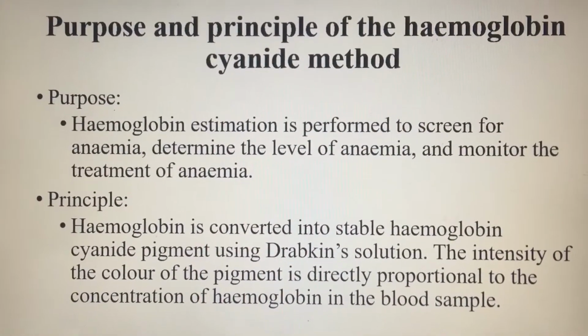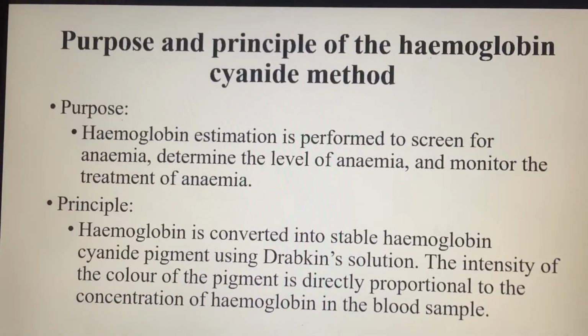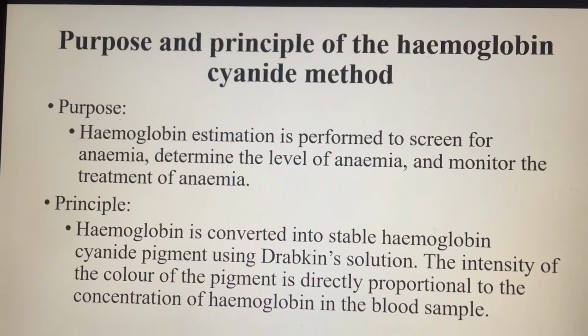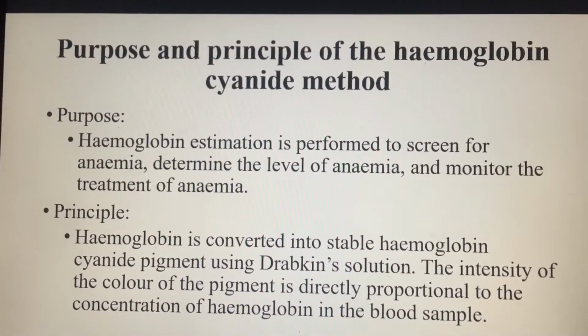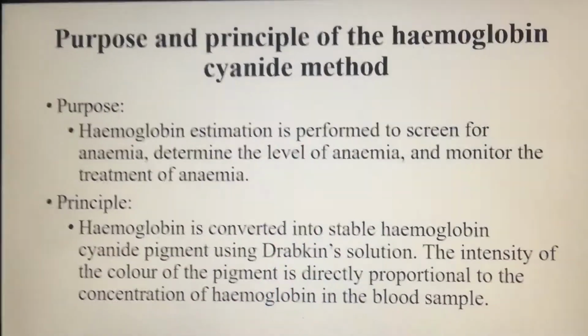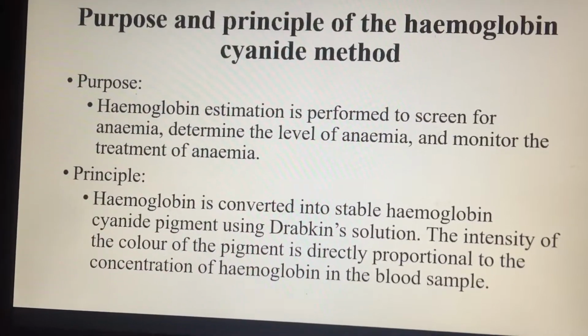Okay guys, let's proceed now with the purpose and principle of the haemoglobin cyanide method. As I told you, that is one of the methods that we are using to determine or to estimate the hemoglobin concentration. So let's begin with the purpose.